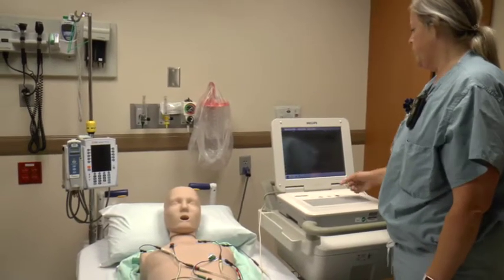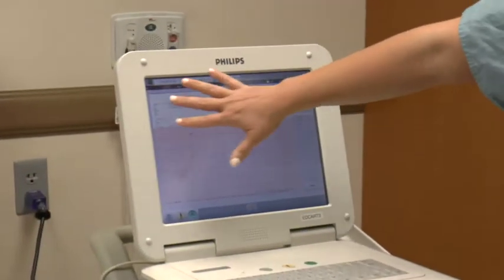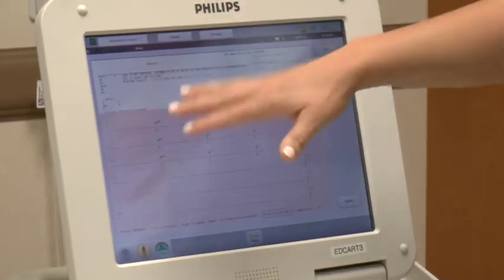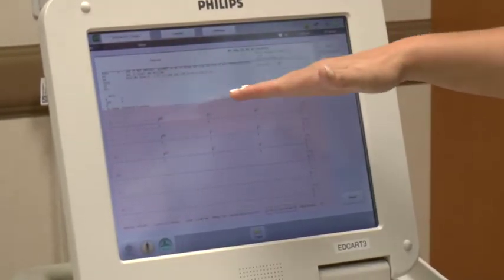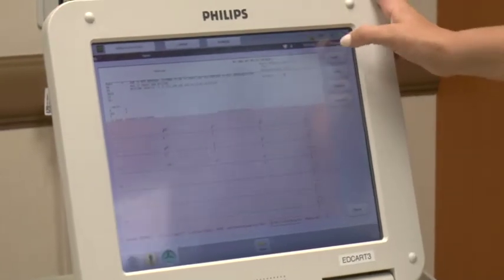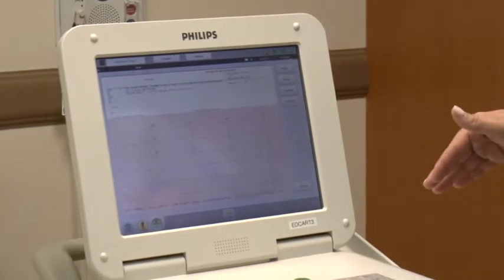Once you get a good picture, hit the ECG button. It will create the tracing and display all the patient's information along with an auto-reading — you can't always rely on that, but it gives a reference. Then hit the print button and it will print that reading. There's also a 'Last ECG' button you can select, which will show any of that patient's prior EKGs — the doctor will want the most recent one they've had before.